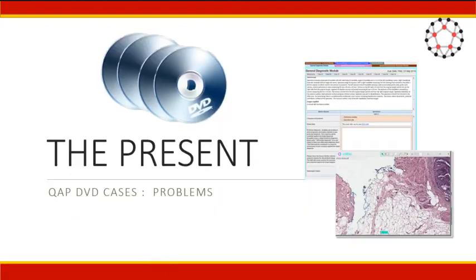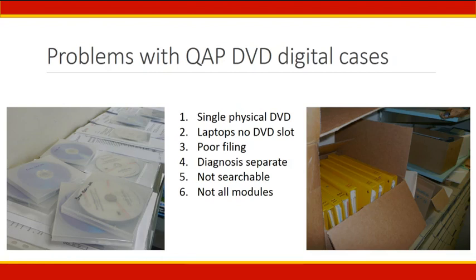Of course, in AP, we have been using digital slides for surgical pathology cases for the QAP for many, many years. And although the current open modules are available to view online via the QAP website, once the module is closed, the online case is no longer available. How many registrars in the room have used QAP DVDs to study digital cases? You would think this would be a great idea.